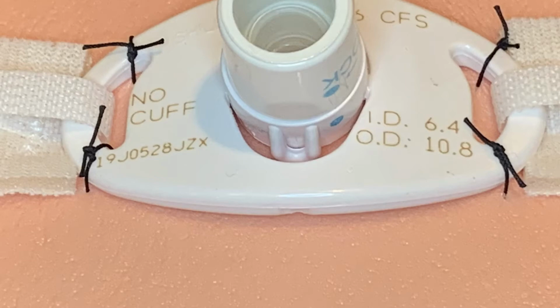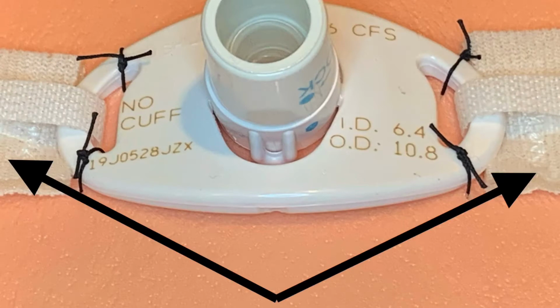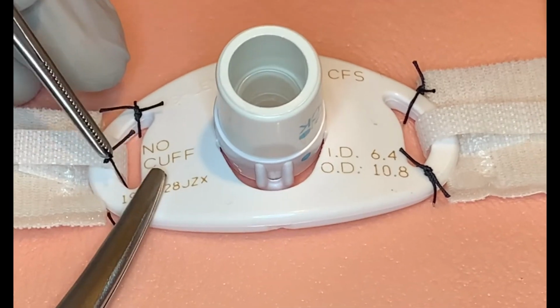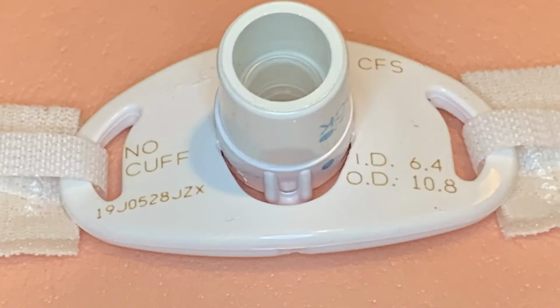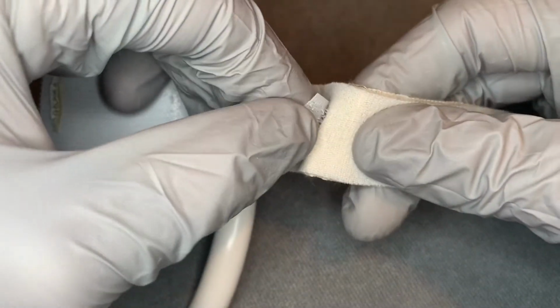Tracheostomy tubes are often secured to the neck with stitches immediately after surgery, along with a collar, referred to as a tracheostomy tie. The stitches and Velcro attach to the flat part of the tracheostomy tube that sits against the neck, known as the plate or flange. After several days, the stitches are removed and the collar alone holds the tracheostomy tube in place. This collar can be adjusted with Velcro to fit the neck.